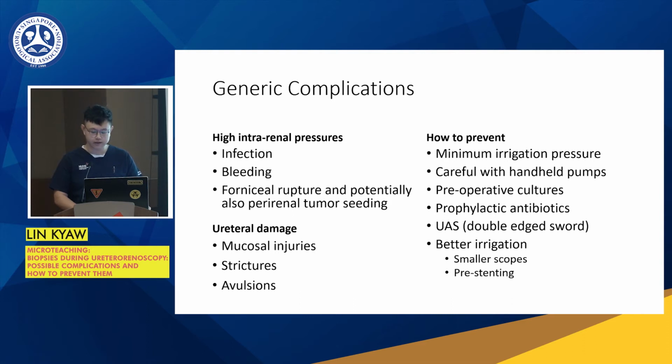The use of a ureteric access sheath seems like a double-edged sword from my readings. On one hand, it helps to reduce the intrarenal pressure, which helps to decrease the potential septic complications. But on the other hand, this may increase the risk of strain-induced lesions to the ureter. Additionally, the advancement of the UAS over a guide wire is most likely done blind. We are not able to visualize or be aware of the peristaltic movements of the ureter, so that in itself can cause some ureteric injury.